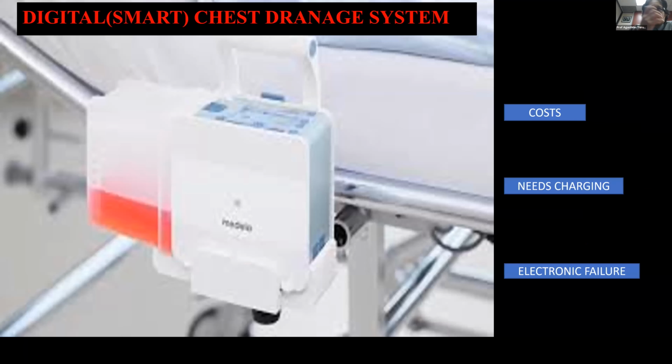However, the problem with the digital system is cost. It's very costly, and it's difficult in third world or developing countries, where the system itself adds a lot more cost to the patient. Secondly, it needs to be charged just like any handphone. And like all electrical things, when the electrical part goes wrong, it's quite chaotic and dangerous to the patient.